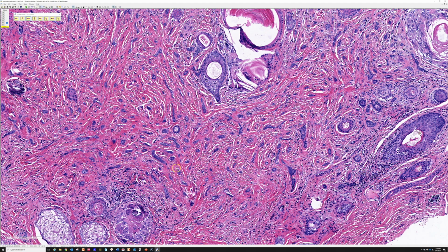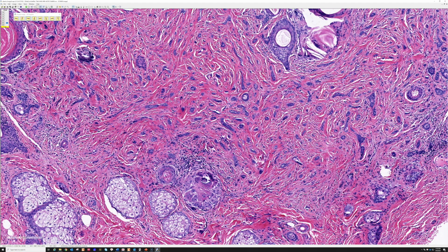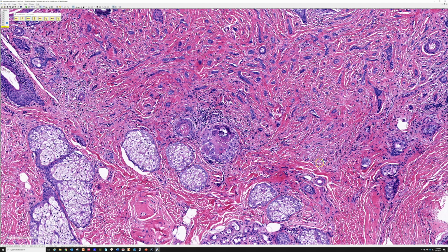Not always, but I would say in the majority of cases, you're going to see some other areas that look more obviously like basal cell. But the problem, I think, is to determine between desmoplastic trichoepithelioma, which is what this case is here, and microcystic adnexal carcinoma. Those two can look essentially identical on H&E, and really the most important thing is seeing the base of the lesion. Microcystic adnexal carcinoma usually infiltrates deeply into the subcutis and even the skeletal muscle.